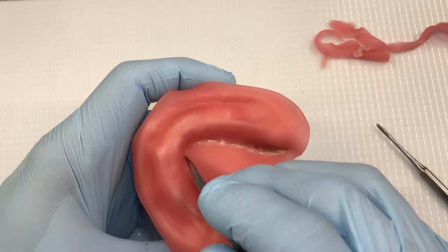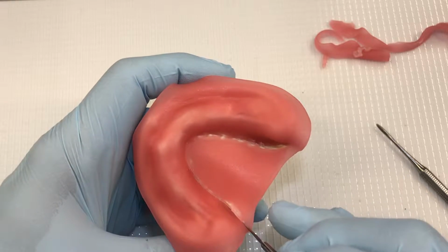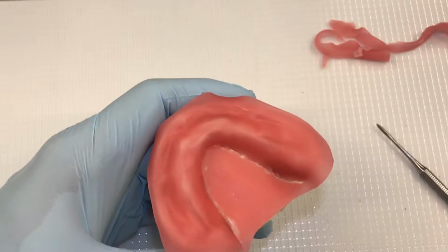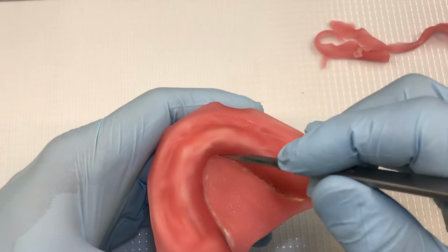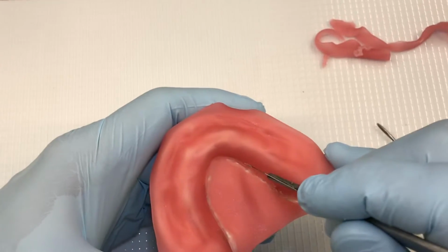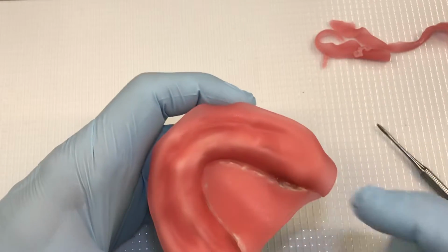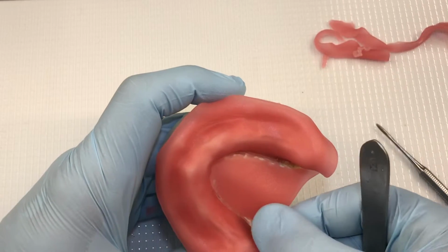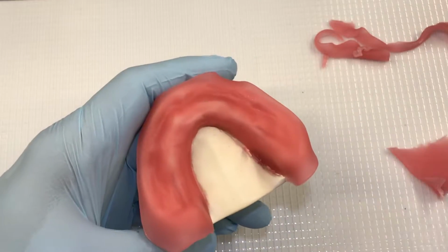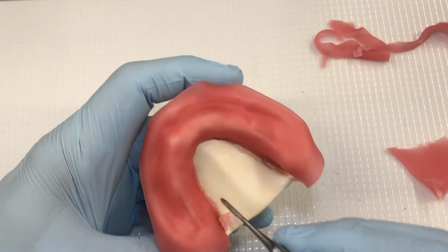So I'm just going to feel with my blade. Try not to put too much pressure because you're going to end up scoring your model, especially if you're using a fresh blade. Heat up my blade a little bit so it glides through the material a little bit easier with less resistance. And I'll remove this little bit here. So we have that effect. Remove some of the excess material that peeled away.